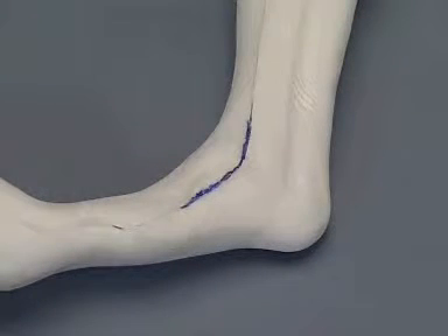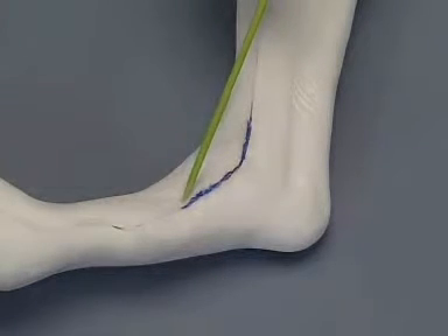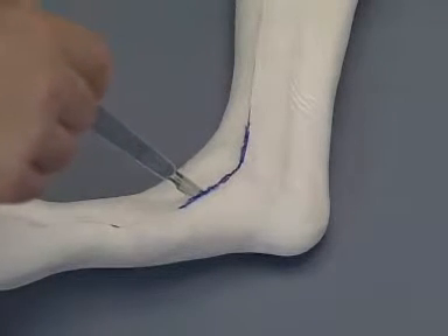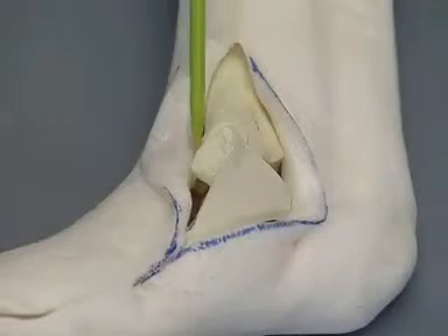The landmarks for the incision for the medial malleolar fracture are the distal tibia, the medial malleolus, and the base of the second metatarsal bone. The foam is incised over the medial aspect of the distal tibia and the tarsus, and the fracture is exposed.